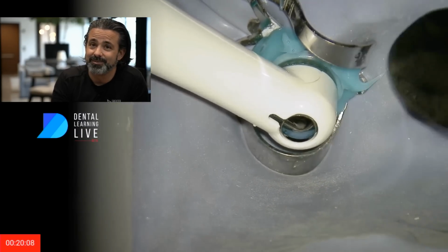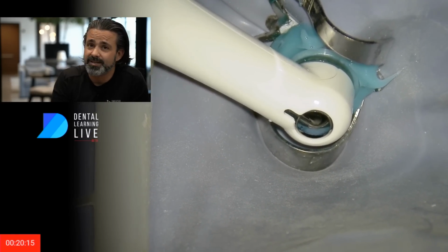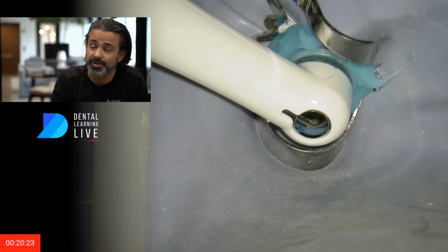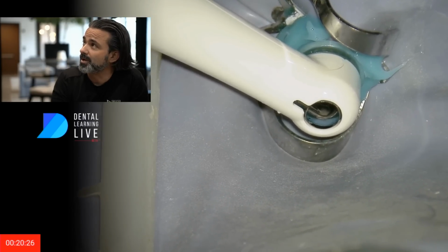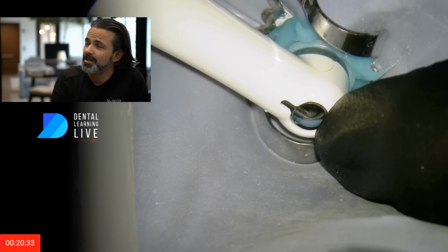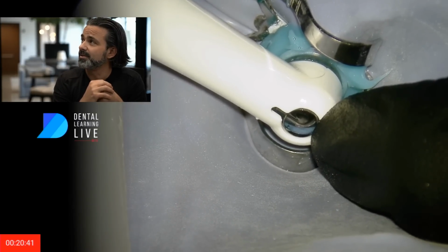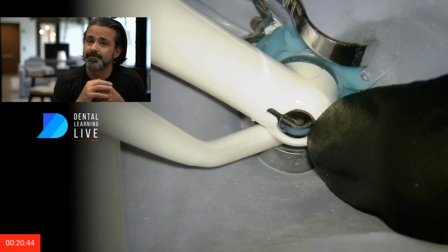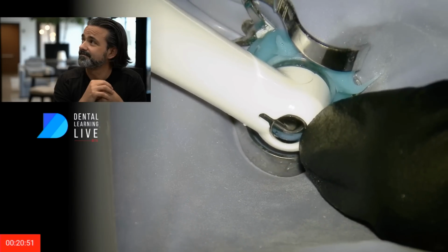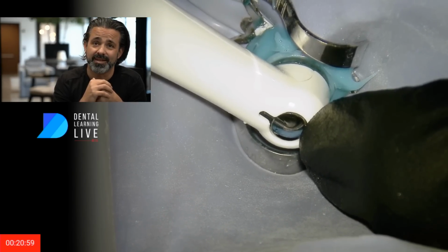So that's why I said it's a great day to make a movie, a GentleWave movie. So that dancing bubble, it's staying pretty consistent, and so that's good. I know those fluid dynamics are working as they should. Looks like we're coming to a close here. And if you notice, when I built that platform, I built it wide, with a lot of girth to it, simply because of the rocking and the movement that you see here. I just don't want it to dislodge off that. It's missing half the crown from all that decay and everything I took out of it.